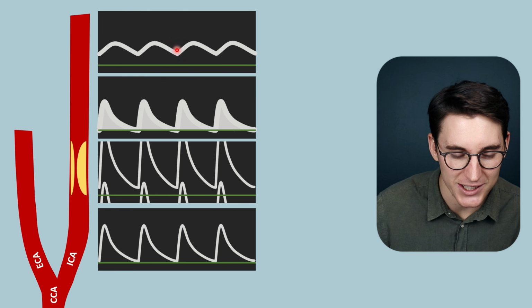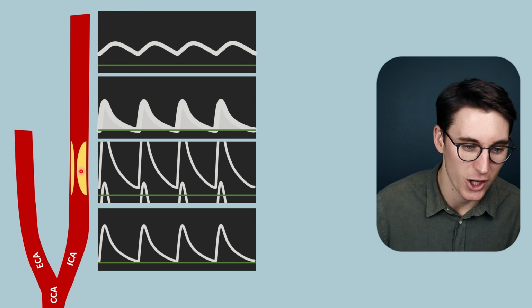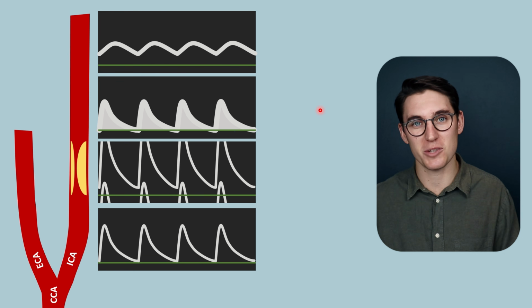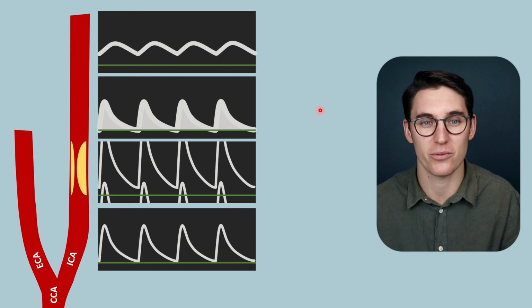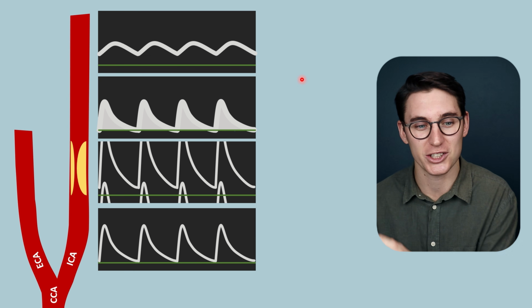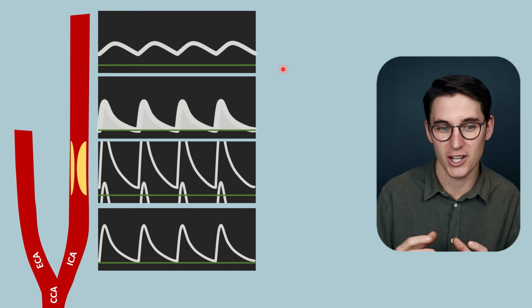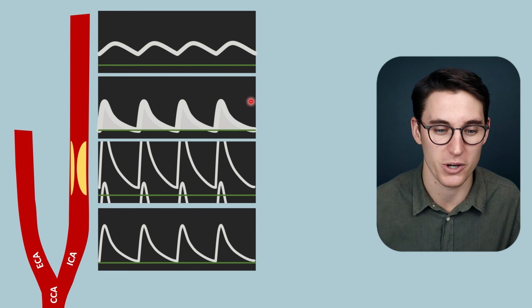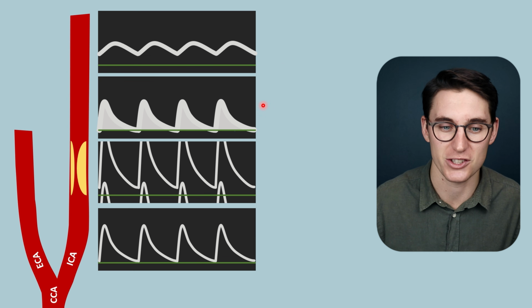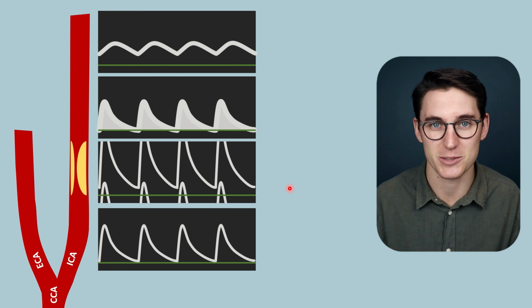Now, why is this diastolic velocity so high? Well, the brain has been starved of oxygen here. We are not getting enough blood supply through this internal carotid artery, and as a compensatory mechanism, we've reduced that peripheral vascular resistance. And that reduction in resistance, that reduction in peripheral vascular pressures means that we get forward flow in the low pressure diastolic state. We are trying to increase that blood flow to the brain. So we can see how a pathology leads to spectral waveform changes and how we can look at these spectral waveforms and try and explain them with underlying physics principles.